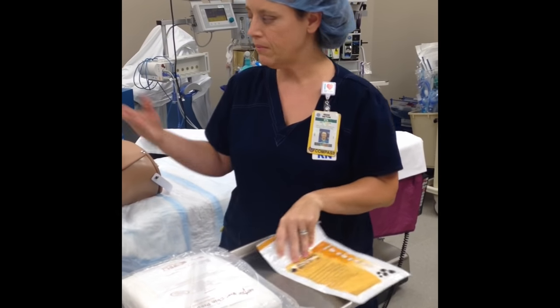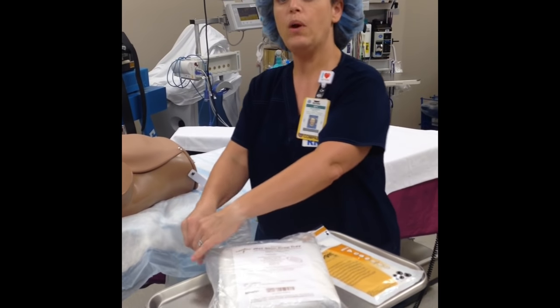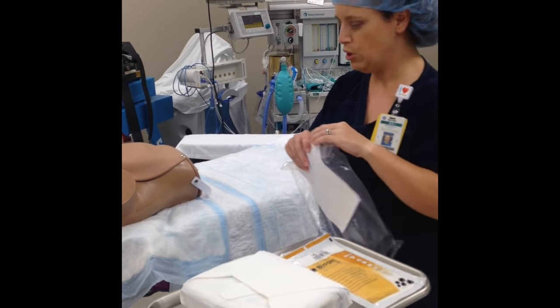You'll gather gloves and then of course you'll position your patient appropriately before you begin. If your patient is awake, make sure that you educate him or her before you touch them as to what you're about to do for them.